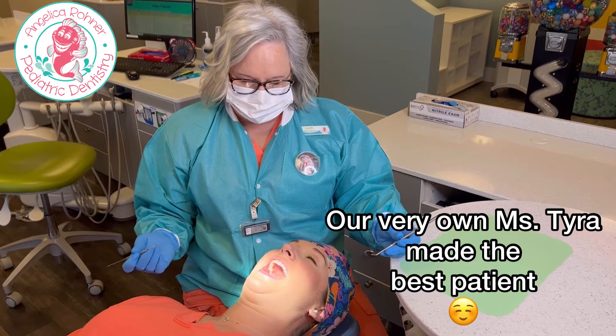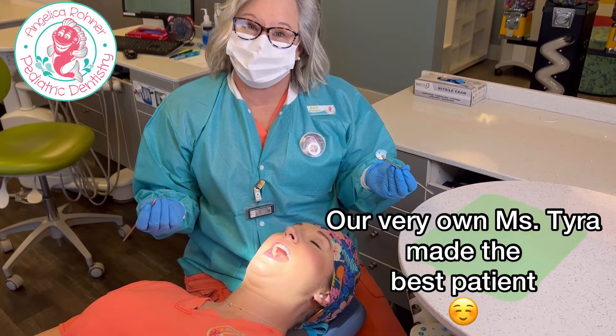Once you're in the chair, Dr. Roehner will use the Mira and Explore just like this.